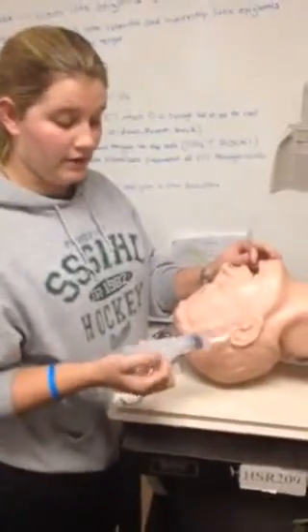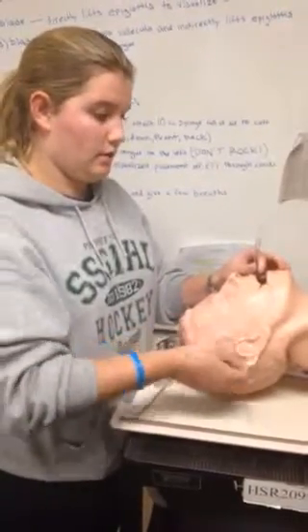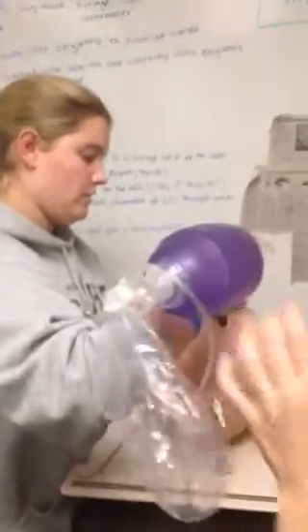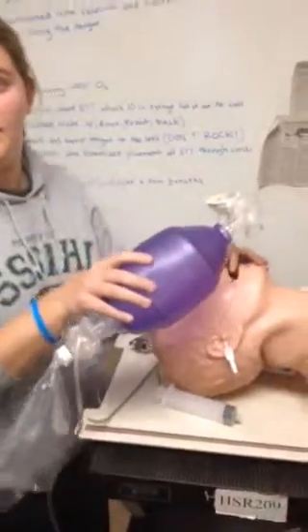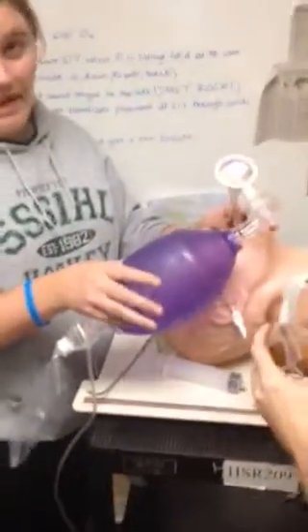At this time we will inflate the cuff. Then we will attach the ETCO2 detector directly on the ET tube and look for it to turn a yellow color, which indicates that CO2 is present and we are in the correct spot. While we are doing that, we will continue to bag the patient.